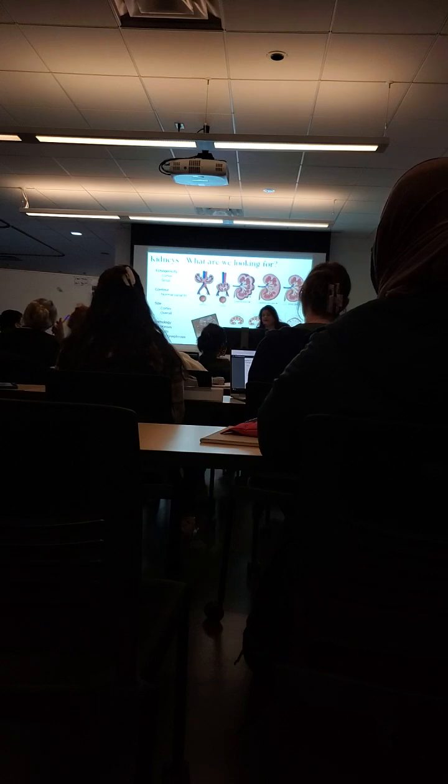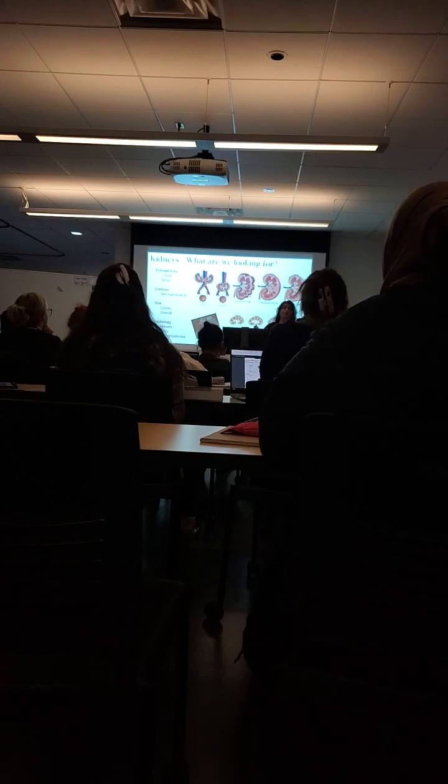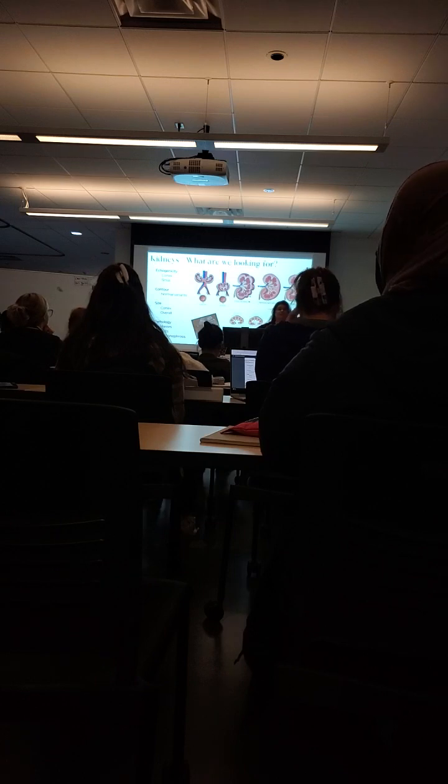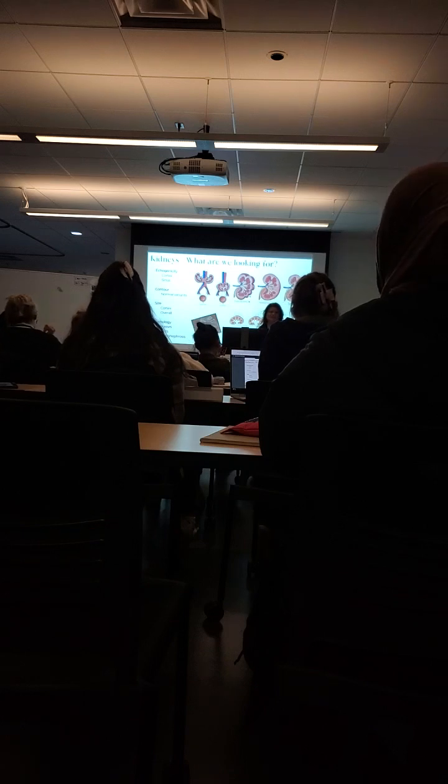So there's a bunch more variants in this, you guys. I just put a few here for you, so you can study it before Rain's class. But the variants can be like one just didn't form, or two of them went like this, and then this one decided to skip over and jump ship, and be like, no, I missed you so much. And then they're together. And you're going to see two little C's like this. You're going to be like, what am I looking at? So this is what a cyst looks like, by the way, right here. See how different that is from a pyramid?